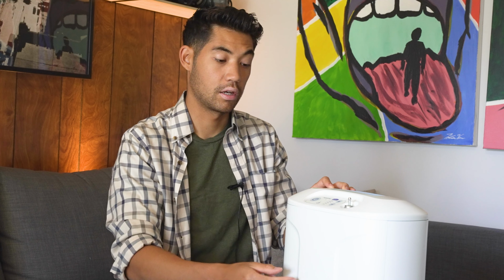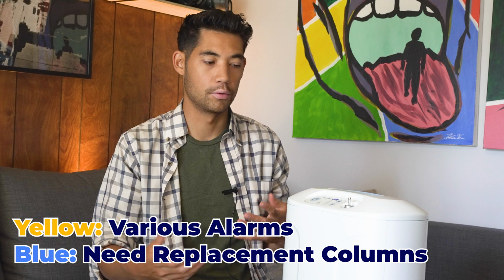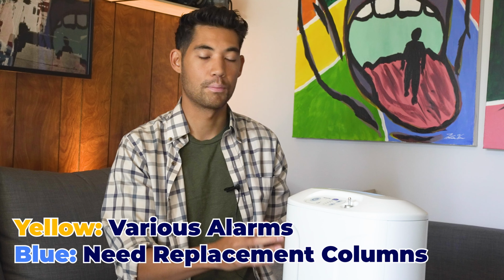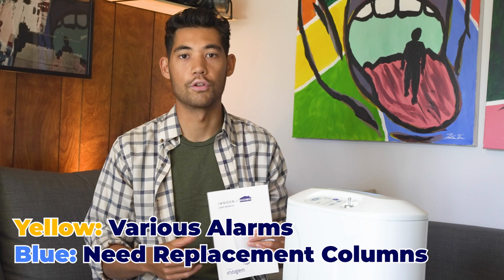So on top here, other than the LEDs for the flow settings, you're going to notice 2 other lights, a blue one and a yellow one. These lights are going to flash depending on an alert that it wants to give you. So make sure that you consult your user manual if they are flashing yellow or blue. Blue generally means you're going to want to replace the columns, so the columns inside need replacement, but the yellow could be all sorts of alarms based on how they're flashing. So just make sure that you consult your user manual.